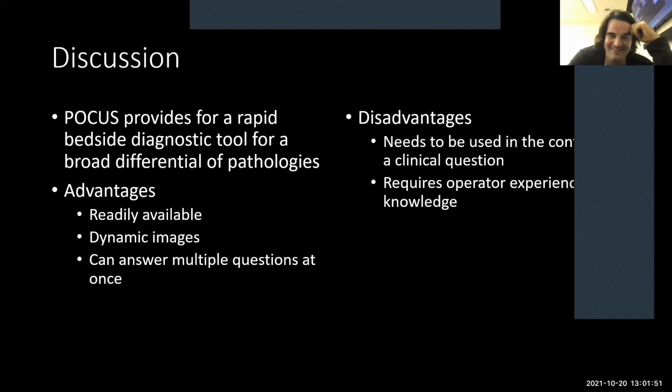So to discuss this case a little bit, this gave us a rapid bedside diagnosis for a broad differential. In this case, I don't even have a digital X-ray, so I can't get these images immediately. We can answer multiple questions at once, and it can certainly be used in both an acute setting as well as, as Brian pointed out, in a diagnostic process. Now, it needs to be used in the context of a clinical question.